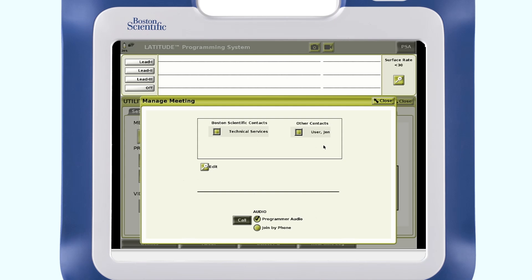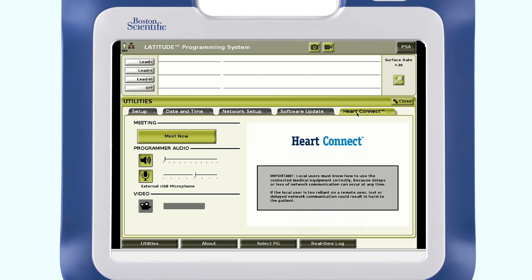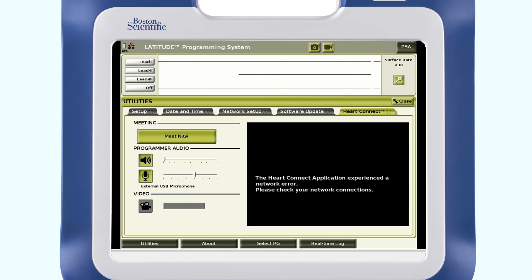When the user has accepted the invitation and is logged in to the remote application, the user will show gold in color and be able to receive calls. Note: if no internet connection is active when pressing the Meet Now button, you will see a screen that says, 'The HeartConnect application experienced a network error. Please check your network connection.'